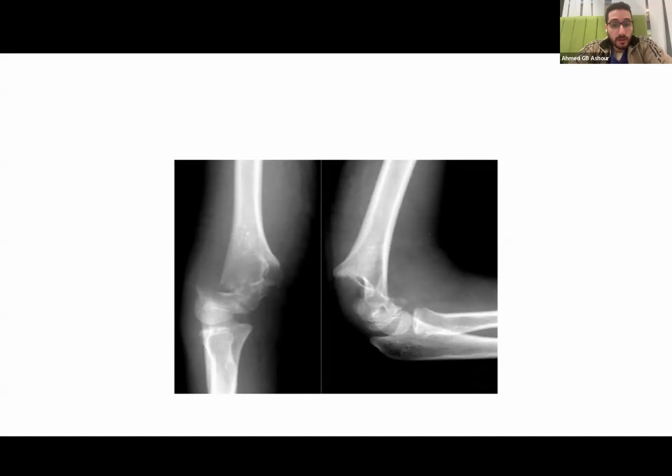Okay. Well done. You described everything. You can put more description on the fracture itself. If you compare the proximal and distal ends of the fracture, you can say there is an element of rotation. Also, you can describe the anterior and posterior humeral lines. This is part of the description. Also, you can describe disruption of the Baumann's angle, which is a coronal deformity. Have a read about it. One more comment, say if this is flexion or extension type. This is important. Okay, good job, thank you.